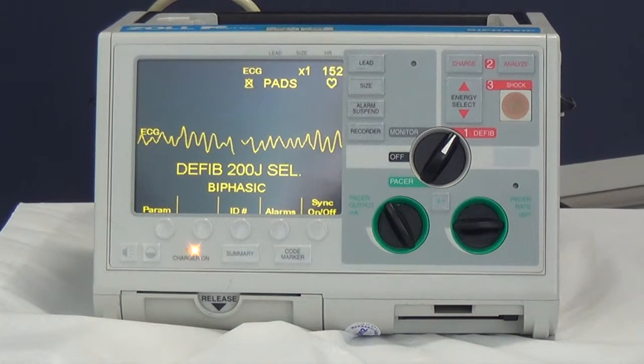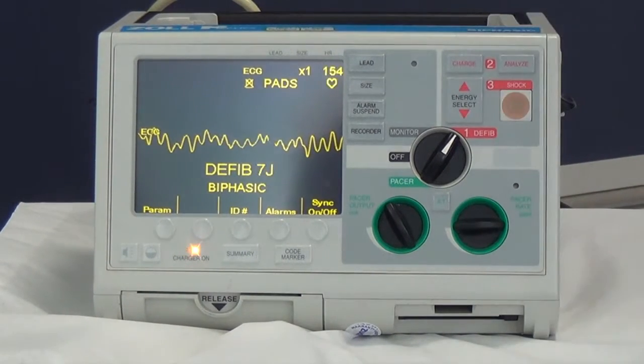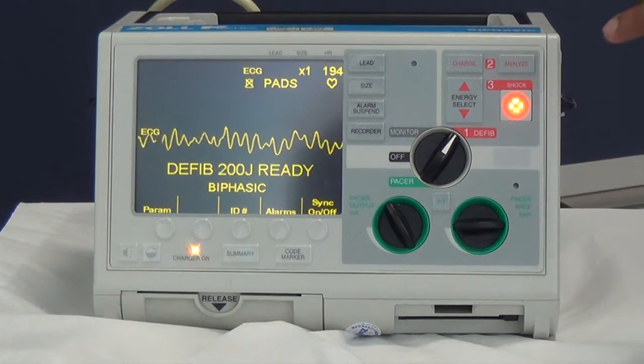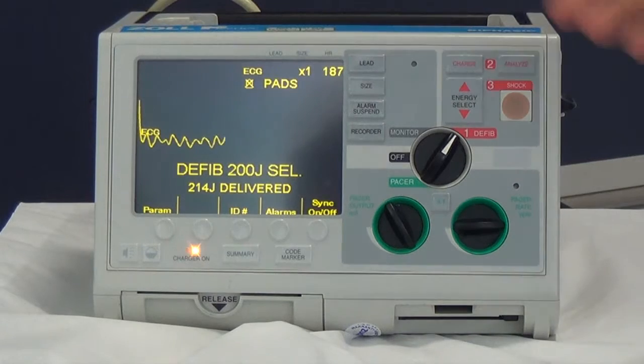Before you deliver your first shock, warn the team that you're going to start charging the defib. Press the charge button — everyone except the person doing CPR should stand clear. Once the light has lit up, confirm everyone is clear and deliver your shock. Then continue CPR.